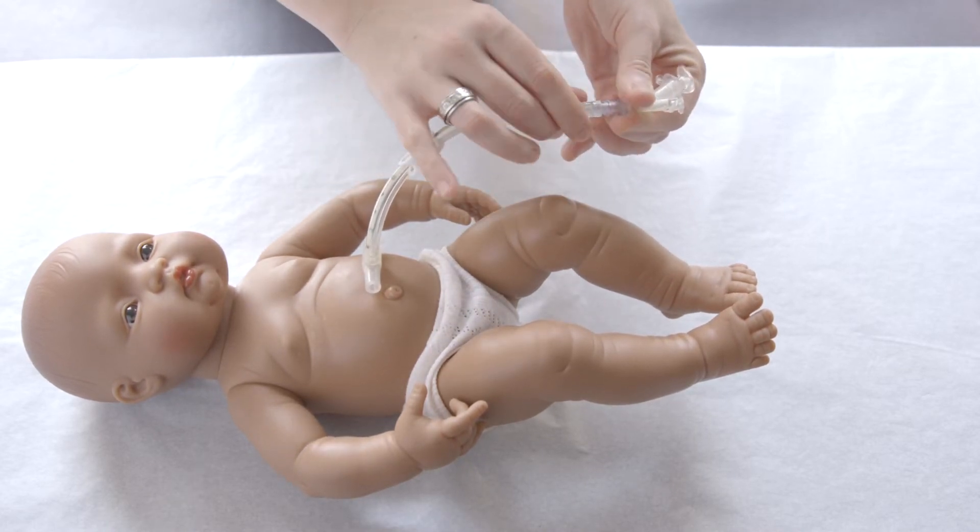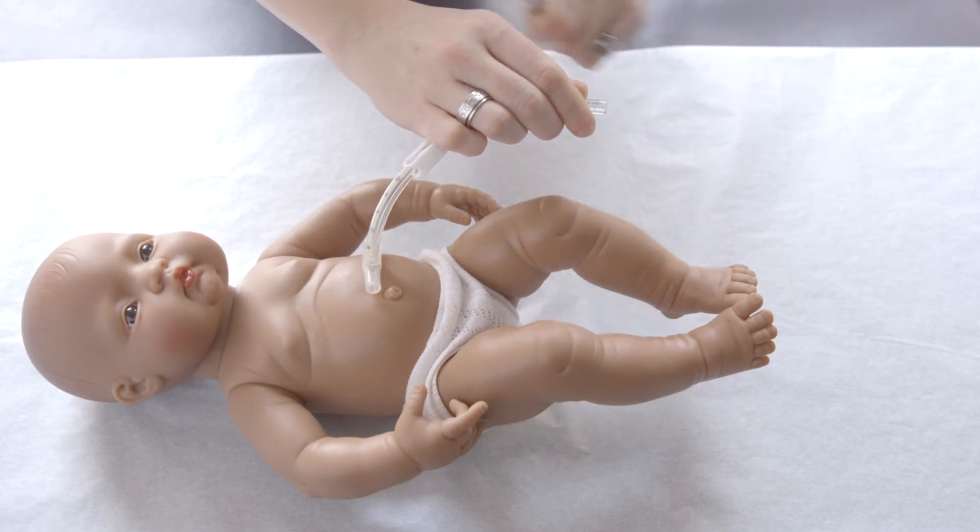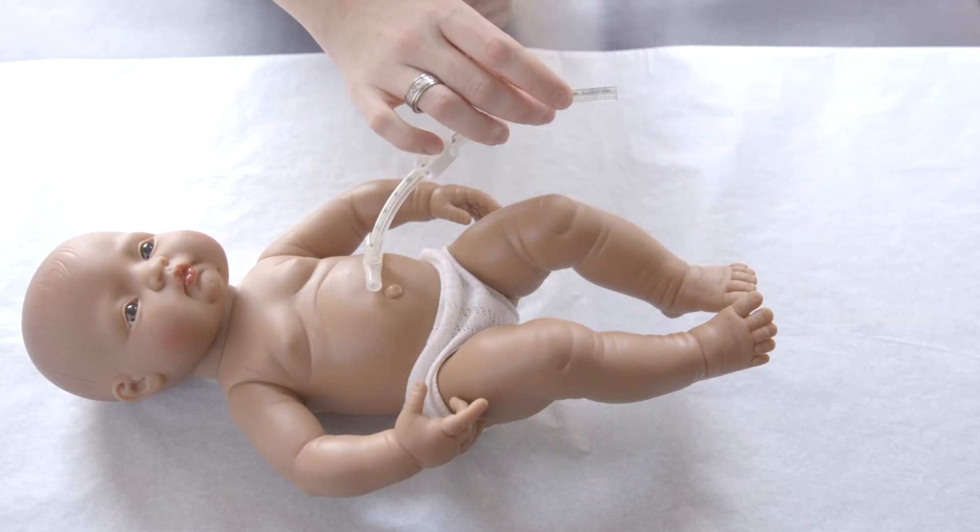Step 3: Remove the Y-Adapter from the tube. Step 4: Remove the skirt from the tube.